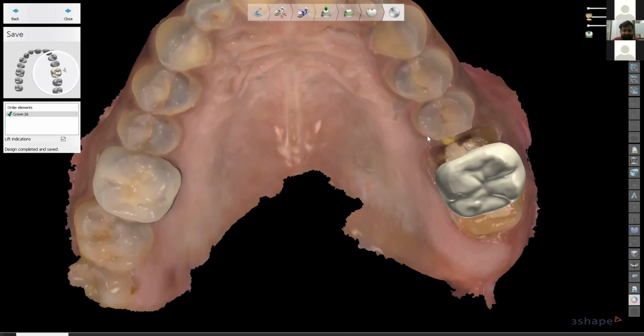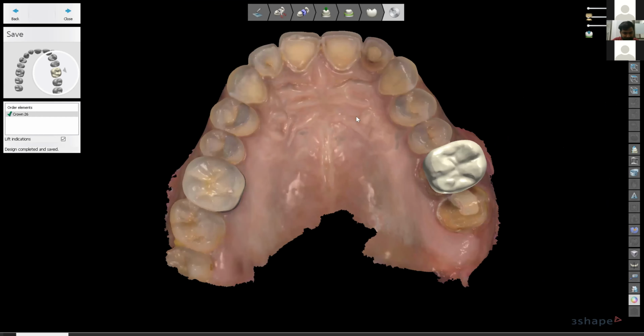Supposing we have scanned our dental implant and we now need to design an abutment. What software would you like to use for designing the abutment? Ma'am, if you're talking about the customized abutment, there is a workflow for scanning it as well, which starts from the intraoral scanning. The person has to take 4 scans. First is the hex scan: the dentist has to scan the hex position intraorally. Second, he or she needs to scan with the scan body.